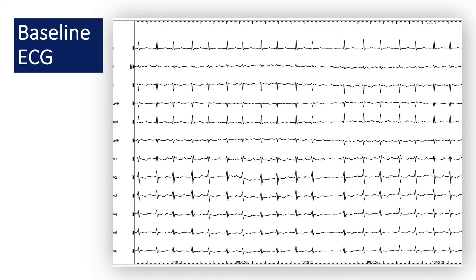The baseline ECG shows an atrial tachycardia with a cycle length of 280 ms. Looking at the precordial leads, we see a positive concordance of flutter waves or P-waves of the atrial tachycardia, which shows an origin from the left atrium.